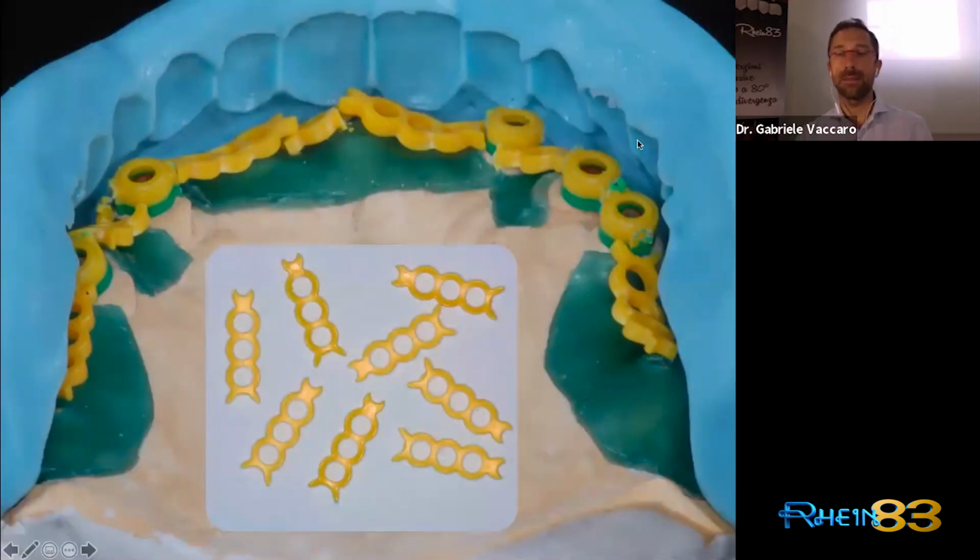They have this kind of silicone mask that gives us the final volume of the denture, so I know where to put the metal frame. That must stay inside this volume.